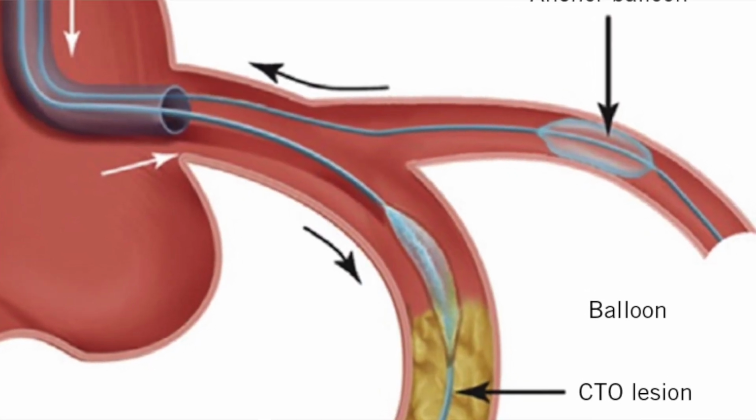Now, guiding catheter in CTO PCI can have several types of problems. Number one is the embolic problems, and the 2 types of common embolism is air embolism and thrombus embolism. And this is more prevalent in CTO PCI because number one, we use trapping balloons. Number two, that we use multiple devices. Often you have a trapping balloon or you have a side balloon anchor and a microcatheter inside. So many devices in the catheter. And number three, the often use of guide extension catheter.